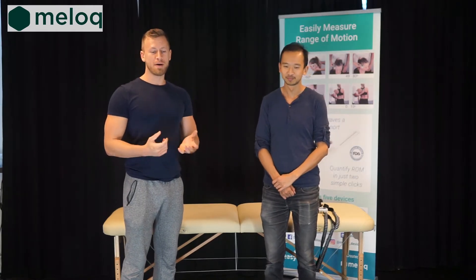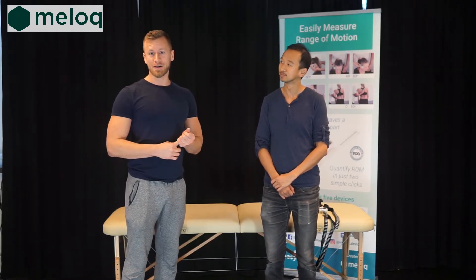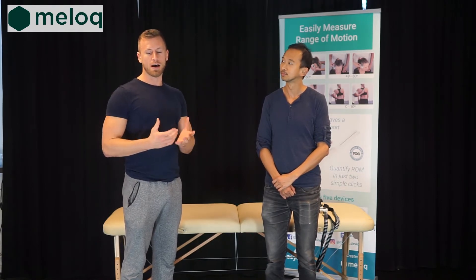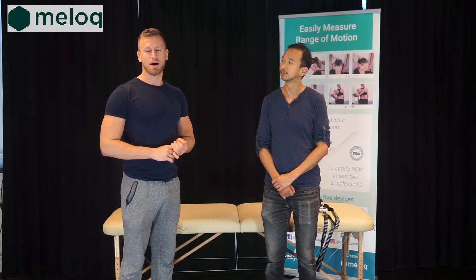Today we will show you the benefits of using EasyAngle and EasyForce together to supplement your functional measurements for a quick, accurate and objective way.